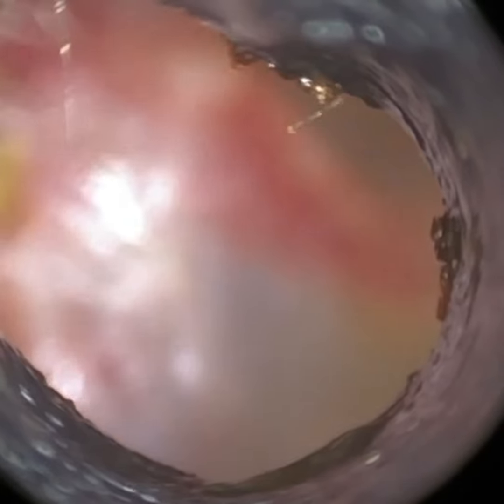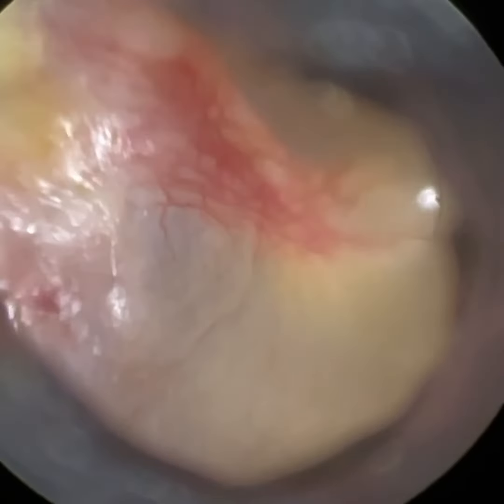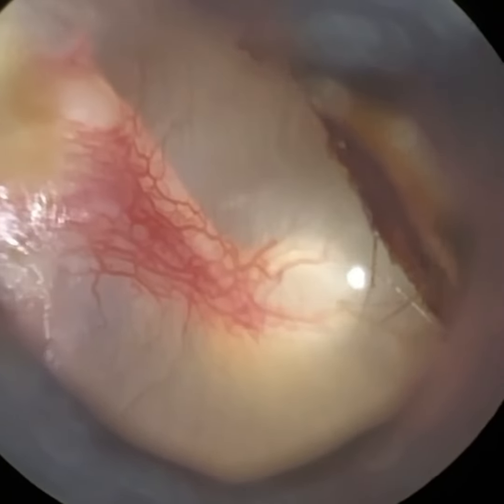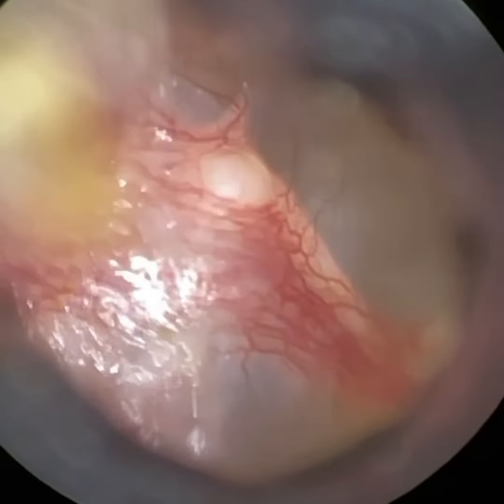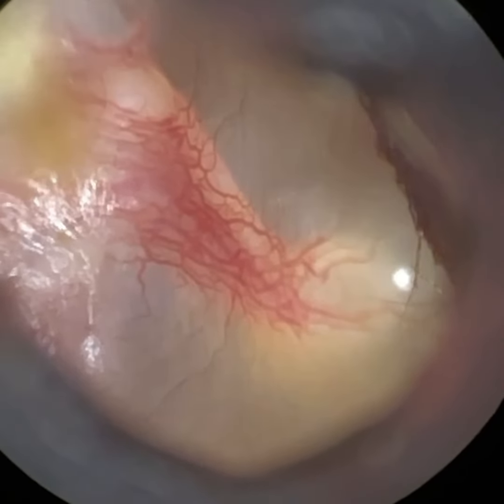You can see this plug is enveloped in dead skin. Do wait for the view of this eardrum — I thought the left one was great, but it was just stunning how clear and vivid. That's the phrase my clinic manager used today when she saw the eardrum in the video: just so vivid. I'm stretching the ear open and adjusting the focus — it's just a breathtaking view. We played this back to the patient and she was in awe as well about how clear it was.